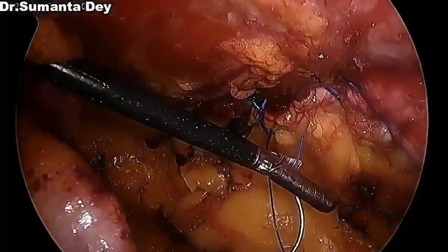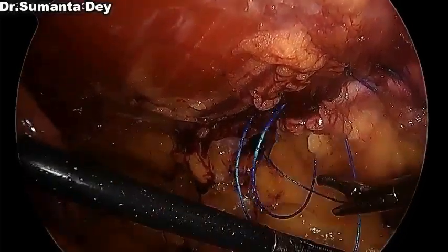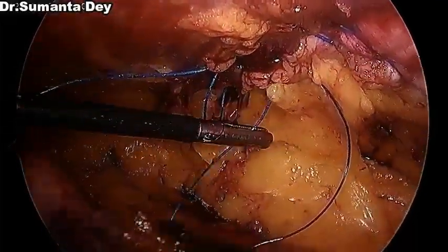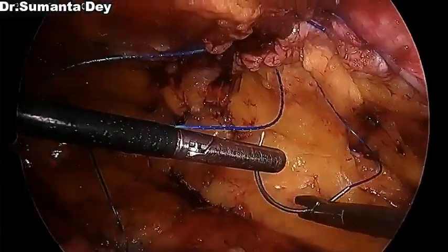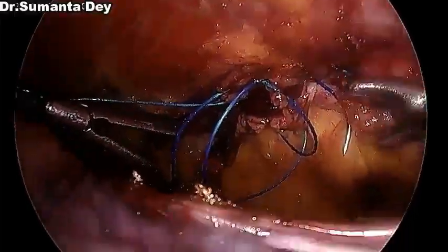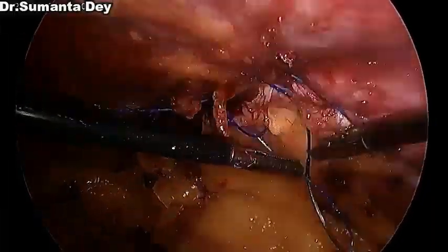laparoscopic suturing. So now, after starting from one end and going to the distal end, I'm coming back to the point from where I started with the same suture, making it a two-layered repair. We'll come back from the lower end up to the point from where I started, and we'll stop there.